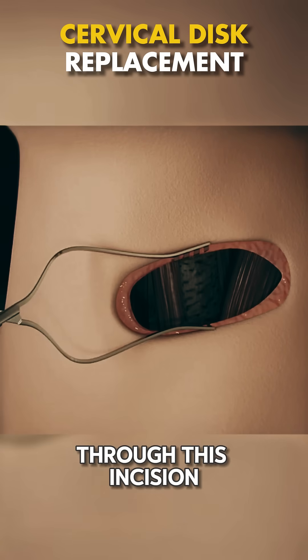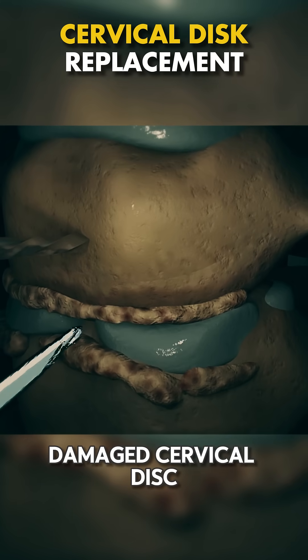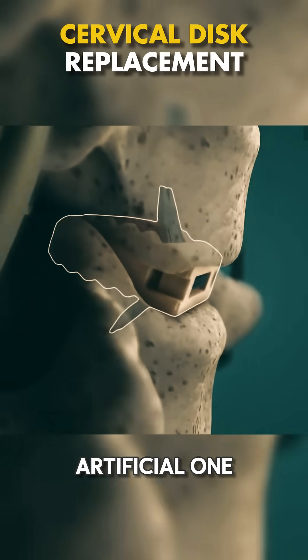Through this incision, they gently move aside the muscles and tissues to reach the damaged cervical disc. The goal? Remove the old disc that's causing pain and replace it with a new artificial one.